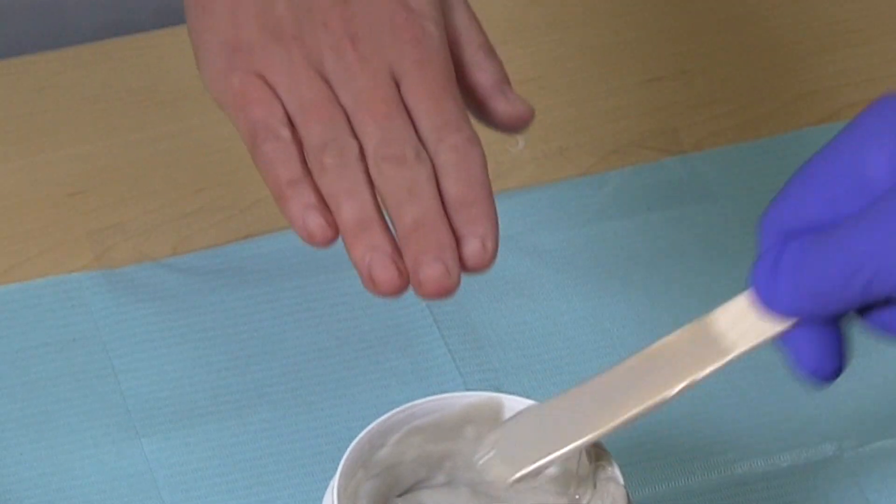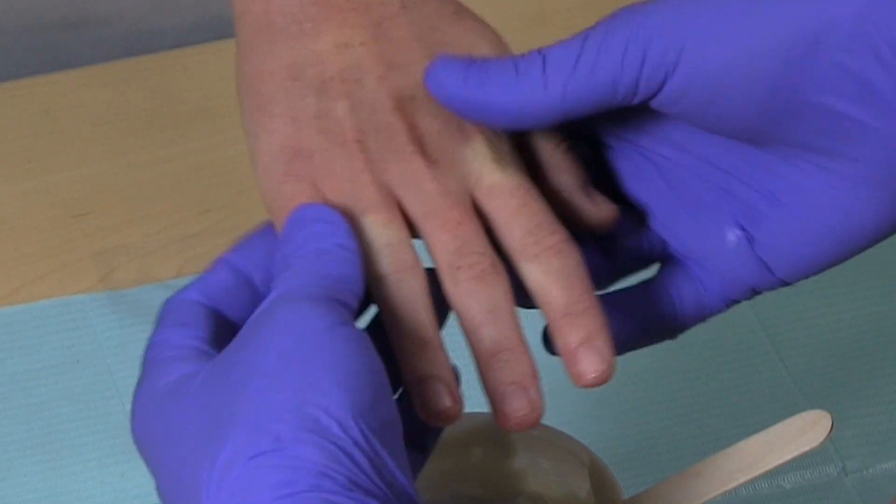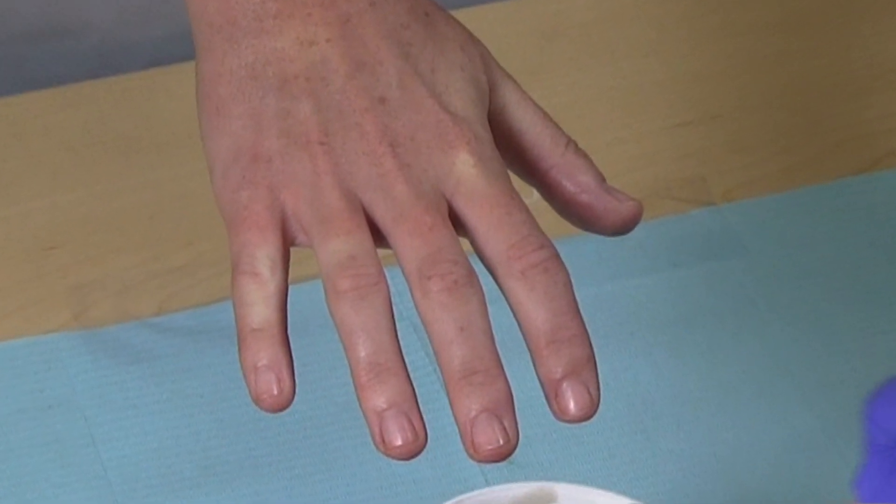Position the customer's hand in a desirable pose. Do not allow the customer to keep the fingers tense or close together. The fingers should be in a relaxed natural position with slight spacing in between each finger.